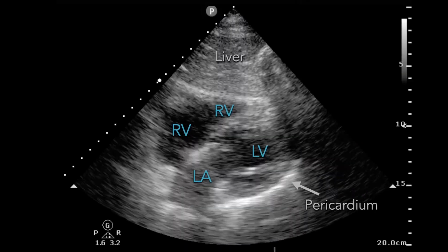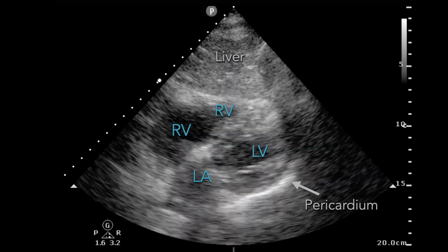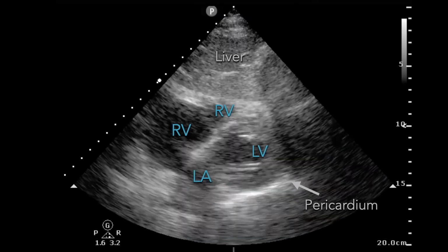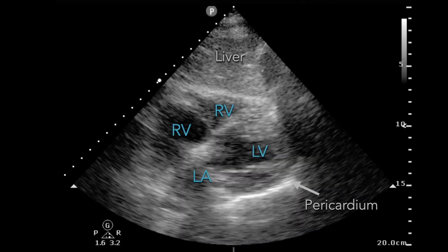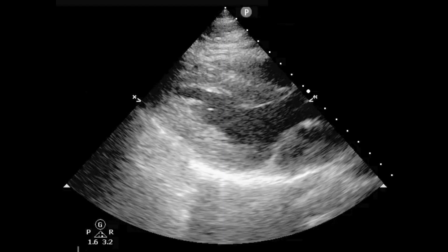And so giving you a little bit more anatomic information here. Here's the different ventricles, so LV, RV, LA, and RA in this particular heart. And so we're looking in that gravity-dependent area for anechoic or sometimes echogenic material that lives within that pericardial sac that may be abnormal as a result of the patient's trauma, right? Now we can go up to the parasternal long axis. So when you don't have a subcostal window that's working for you, right?